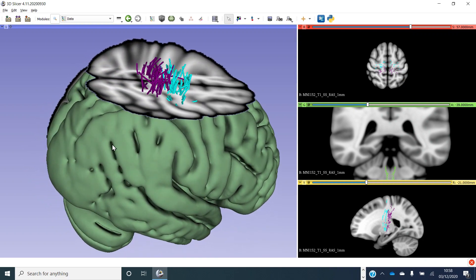Now we're going to follow this down even further. In the sagittal view, we can see the trajectory of these fibres down through the deep white matter, and we can see that topography is maintained, with the blue motor fibres running anteriorly and the purple sensory fibres running posteriorly.